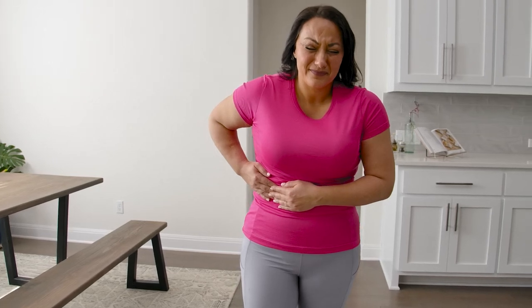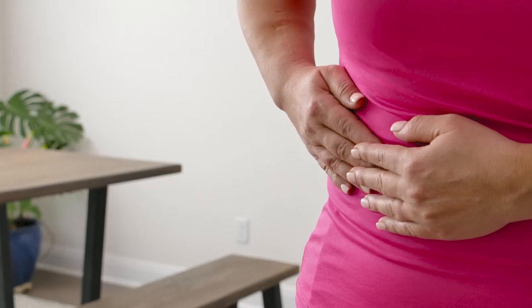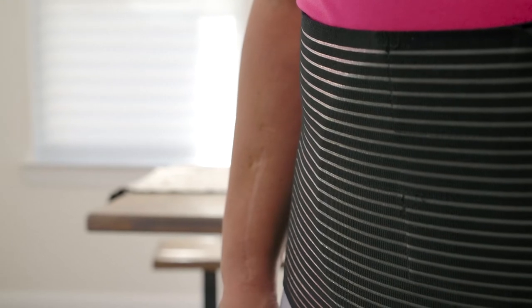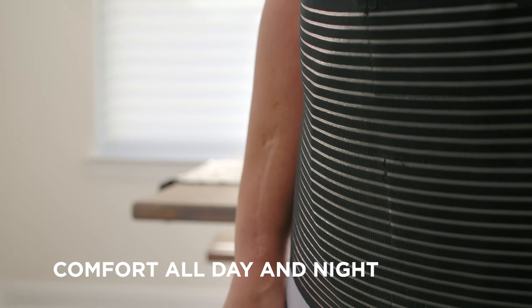Alleviate hernia pain from abdominal, stomach, umbilical, navel hernias and other related injuries with the Armstrong America Hernia Belt and Pressure Pad. Our hernia belt helps soothe the pain by keeping your umbilical region secure and comfortable all day and night.